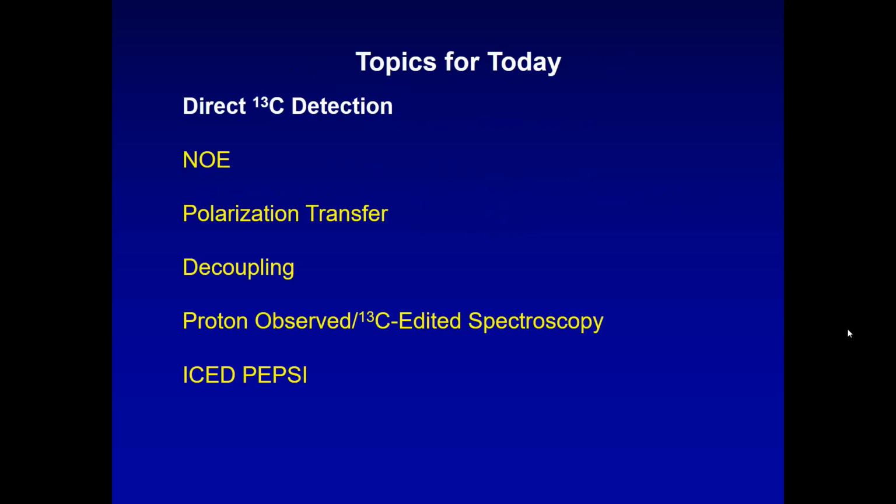These methods can be applied in vivo. We will start with direct detection, because they can be broken down into approaches that observe carbon-13 itself, or approaches that observe protons, hydrogen, that is coupled to carbon-13, or hybrids in between that manipulate the magnetization between proton and carbon.